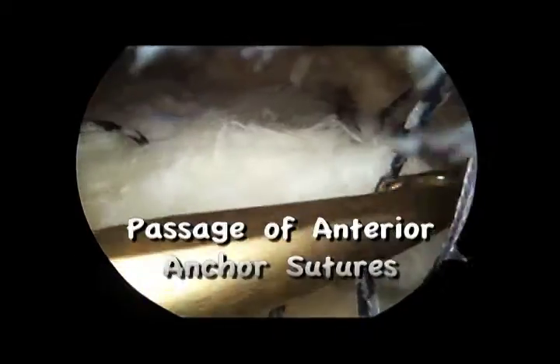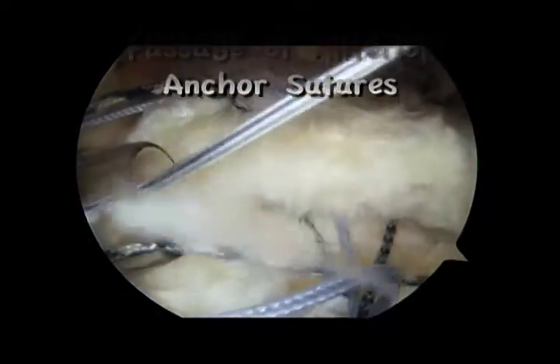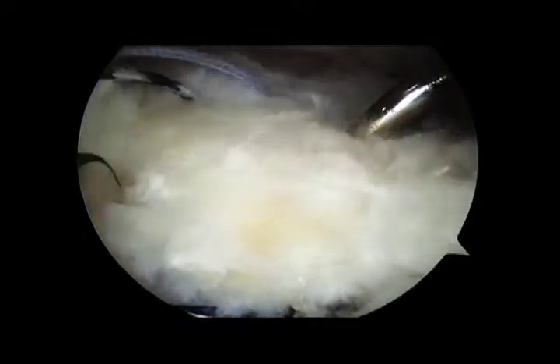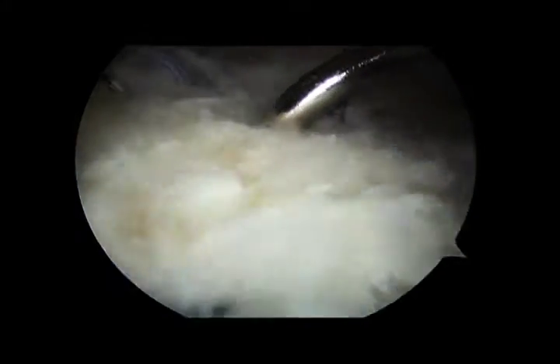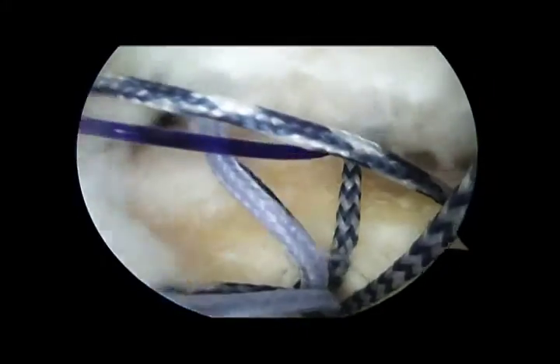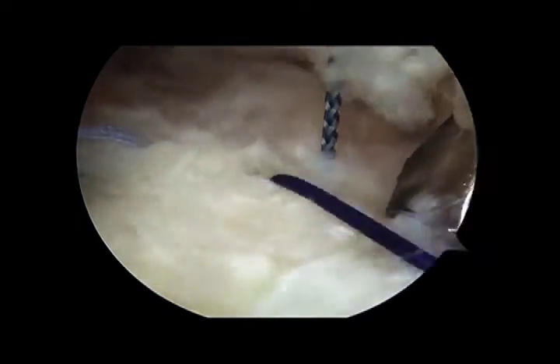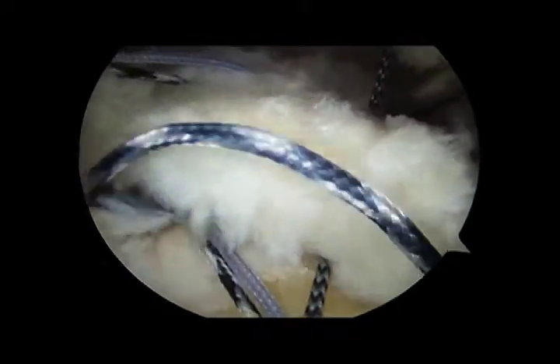The medial limb of the most posterior suture from the anterior anchor is then retrieved at the posterior cannula. A suture shuttling device is seen passing a PDS suture, which is retrieved at the posterior cannula. It is of note that this shuttling device pierced the rotator cuff between and slightly lateral to the middle and anterior sutures from the posterior anchor. This position can be seen here as the PDS suture is retrieved, shuttling the posterior suture through the cuff and out the anterior cannula.